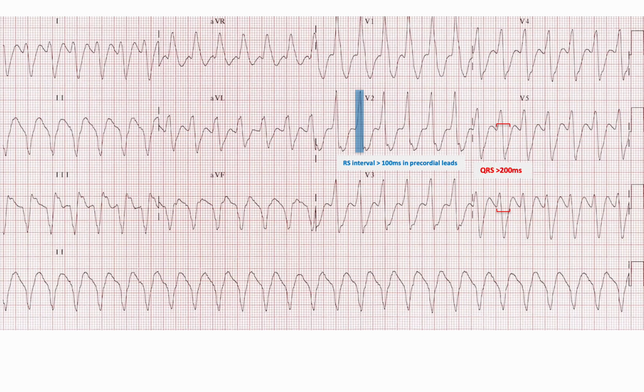Monophasic R waves in V1 combined with RS complexes and terminal S wave slurring in V6 is very typical of a right bundle branch pattern. Remembering our morphologic criteria for right bundle branch type wide complex rhythms, we see that S waves in V6 are bigger than the R waves, or an R to S ratio less than 1.